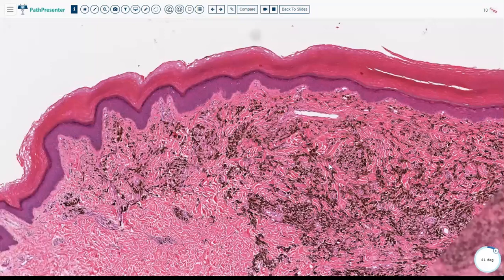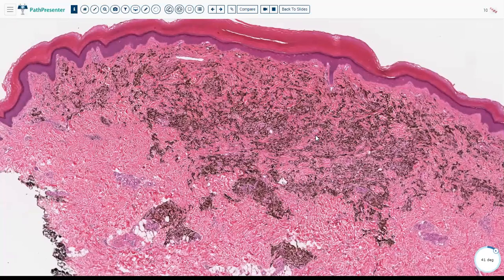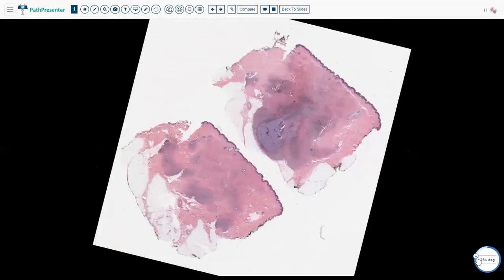So this is a good example of a common blue nevus, which usually is seen either near birth or around puberty, and you usually find them on the scalp or in the acral areas. The distinctive dermoscopic feature is a general blue color without any other features. This is another type of blue nevus. We call it the cellular blue nevus.